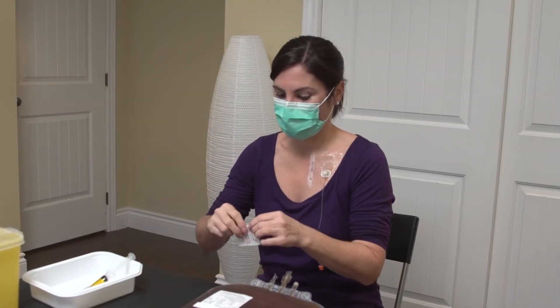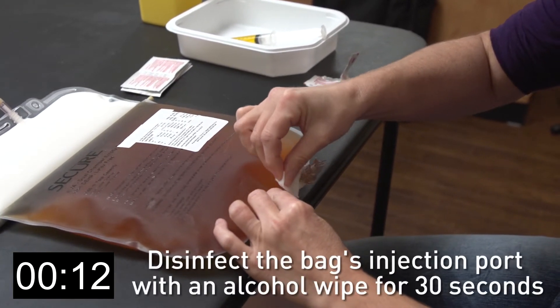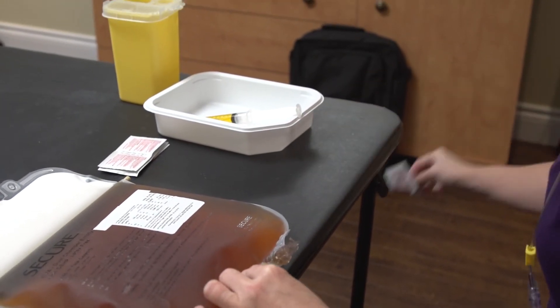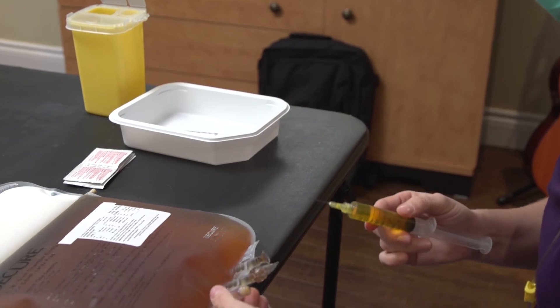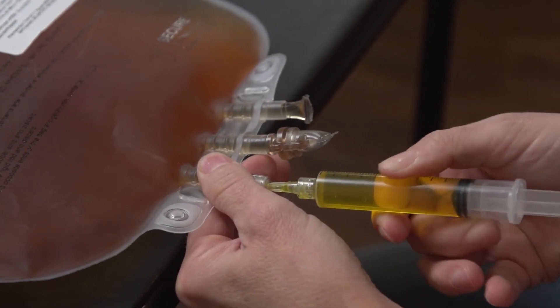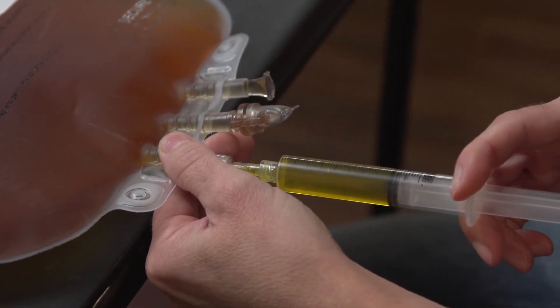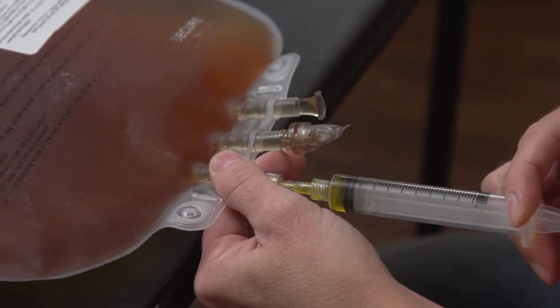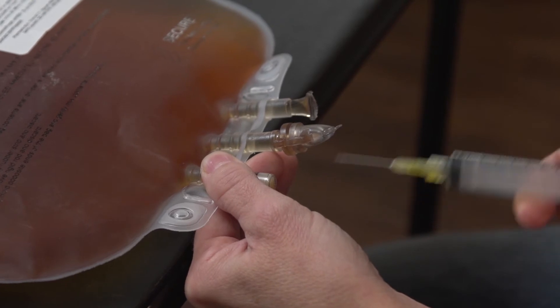Disinfect the injection port of the solution bag with a new alcohol wipe for 30 seconds. Discard the alcohol wipe in the wastebasket. Hold the 10 milliliter syringe in one hand and remove its protective cap with the other. Insert the needle into the bag's injection port, making sure that it is parallel to the work surface to avoid puncturing the bag. Push the plunger, making sure that the syringe's contents are entering the bag properly. Remove the needle, cap it, and place the syringe in the tray.